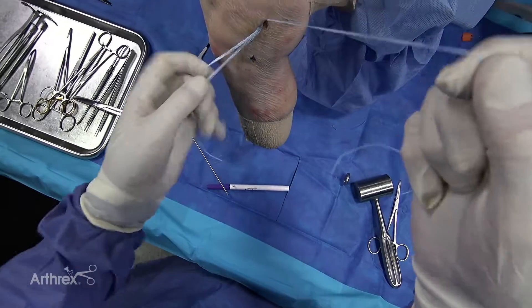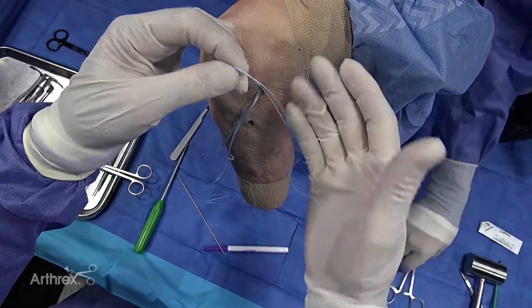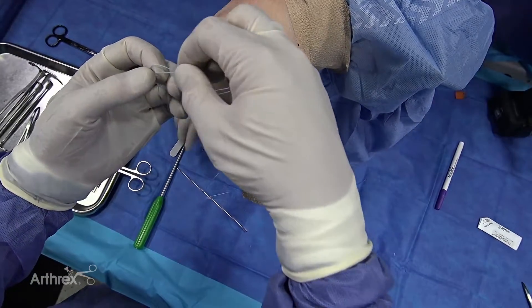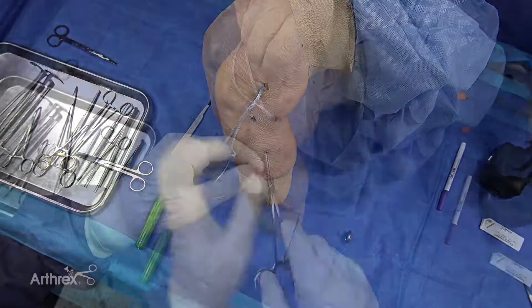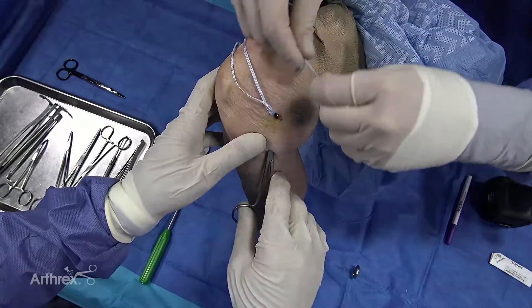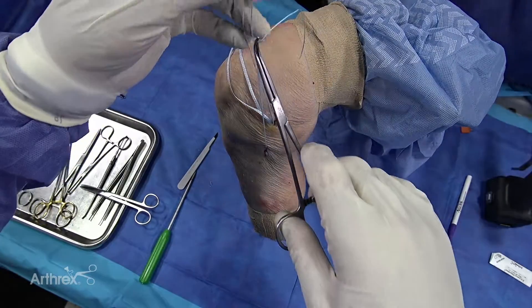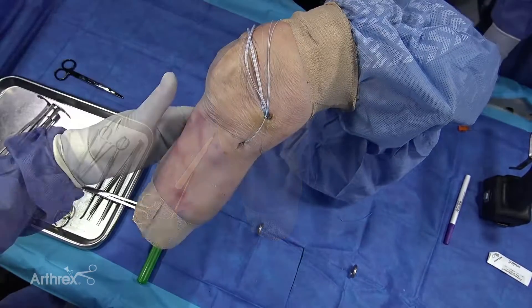Sometimes you may use these sutures to augment the repair if that's the side it's torn off — whether it's off the femoral side or the distal tibial side. But for this case, we're just going to remove that. And what you can do is you can take a right angle up here, grab your suture, and put this through here like this, right on top of the superficial medial collateral ligament.